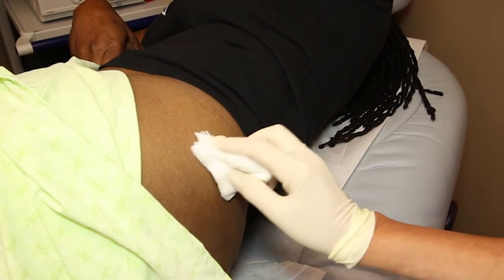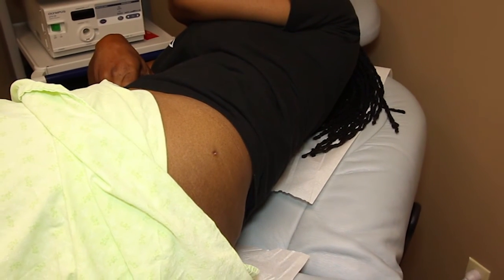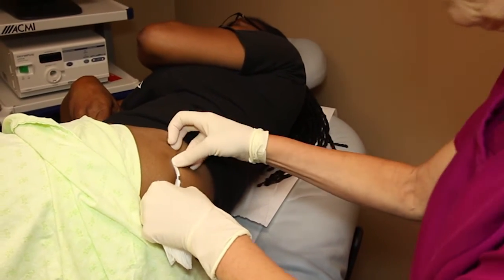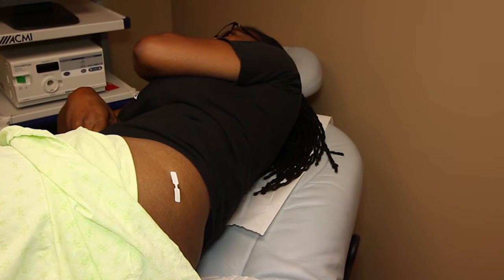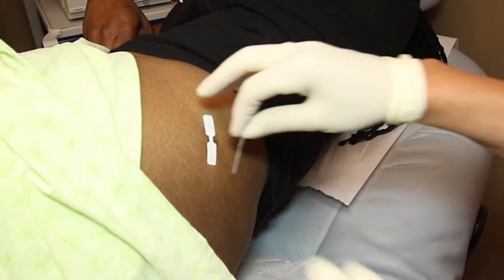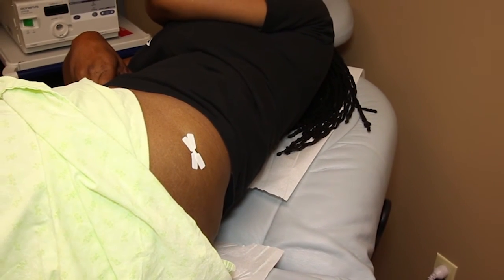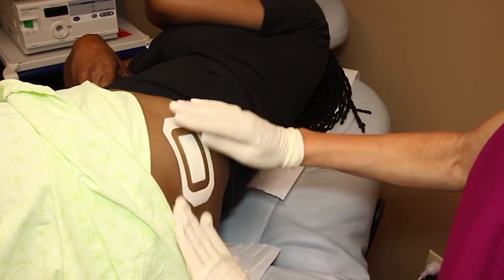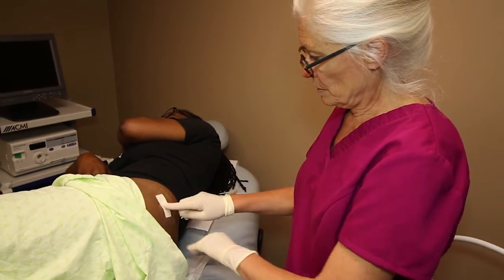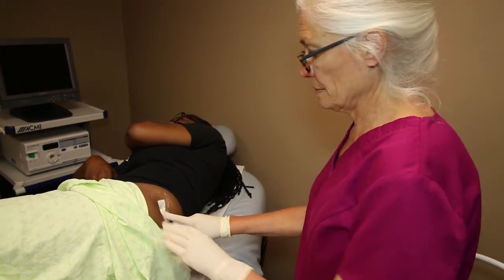I'm going to check to see if there's any bleeding — there's not, as you can see. I'm going to cover this tiny nick in the skin with two little sterile strips and a waterproof band-aid. Patients are instructed that they can shower, but not to immerse themselves in water for about four days. This whole cluster of two sterile strips and band-aid come off in about four days. And that's it — pellet placement.